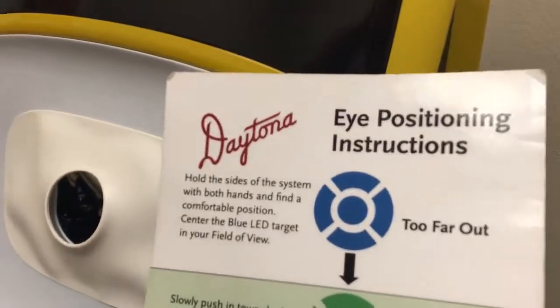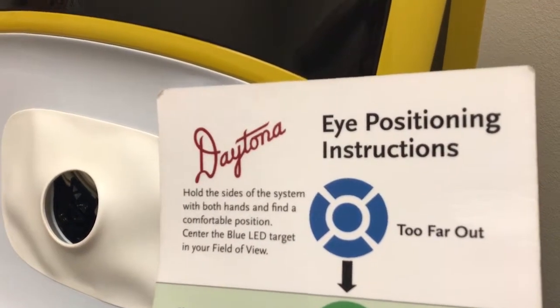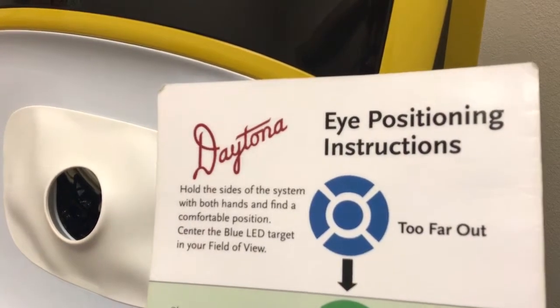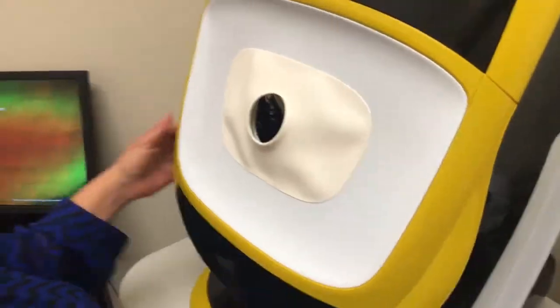and you explain it to your patient while it's warming up. So you say: all right ma'am, you're going to see this blue target inside that hole. What you need to do is line your eye up with the center circle. Once you get it centered in the middle of that circle, I'll tell you what to do from there. Go ahead and hold on to the yellow sides right here, and I'm going to shut the light off. Go ahead and turn your nose to the left and put your eye inside that hole.